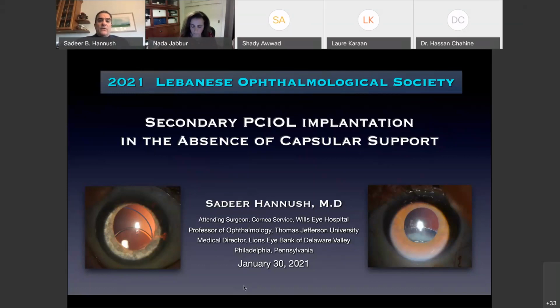And the one thing I've learned over the past 30 some years is if you're going to do this type of work, you need a certain degree of commitment to this part of your practice. This is not something you want to do every 1 or 2 months. And the reason I say that is because based on the epidemiology of disease, if you will, of this type of problem, any one ophthalmologist is not going to see enough of this to be able to do it regularly.